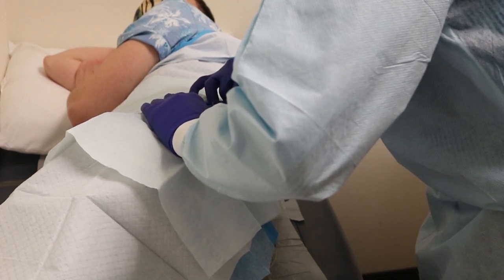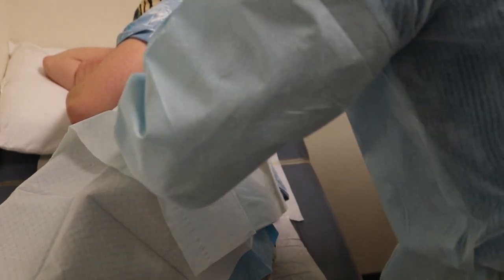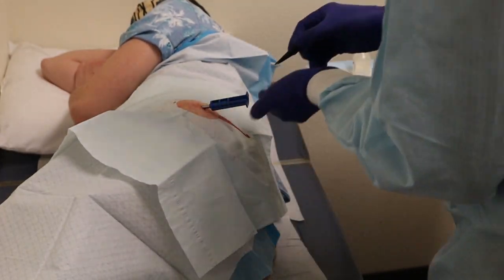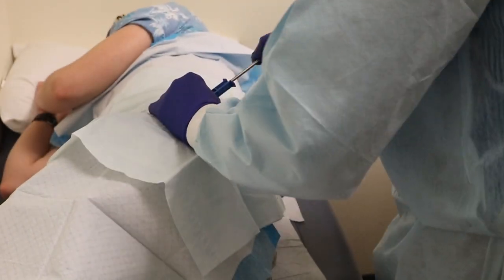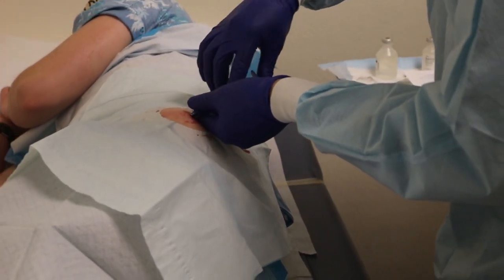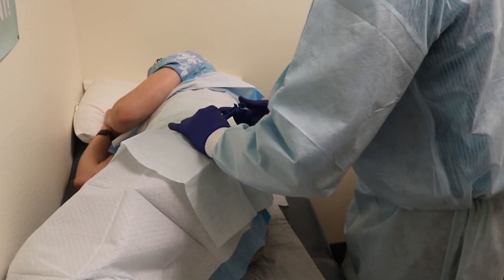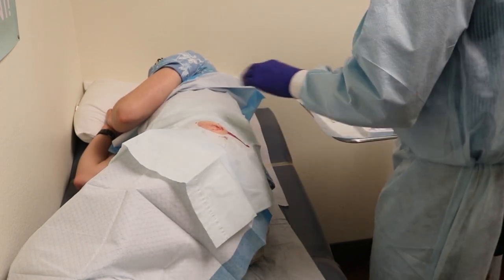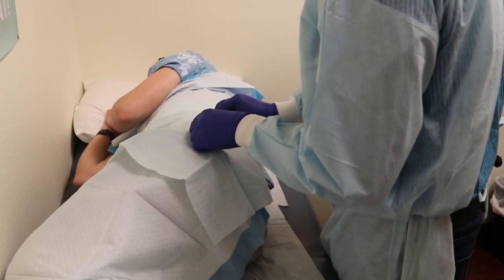The patient asks about bruising. Dr. Singh says it will be minimal. The patient gives ongoing feedback: 'I feel nothing really — it just feels weird. It doesn't hurt.' Dr. Singh says, 'We can always numb it a little bit more if we need to.' The patient says that's good, and remarks that the experience is 'freaking trippy.'